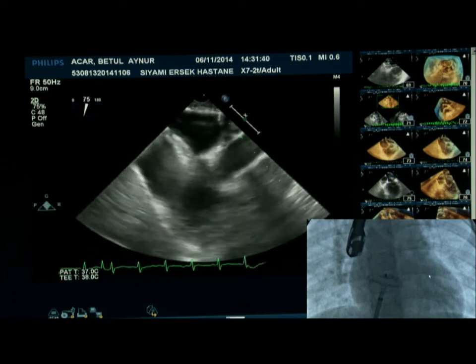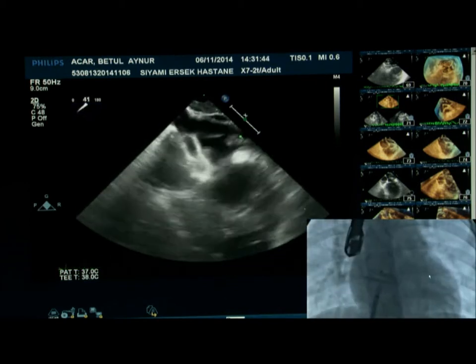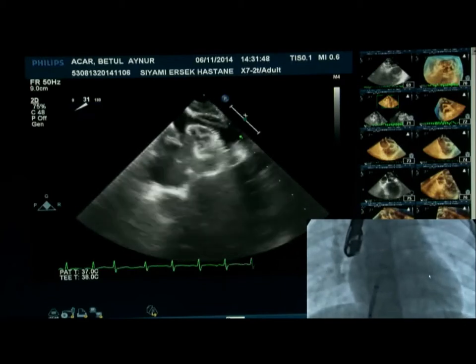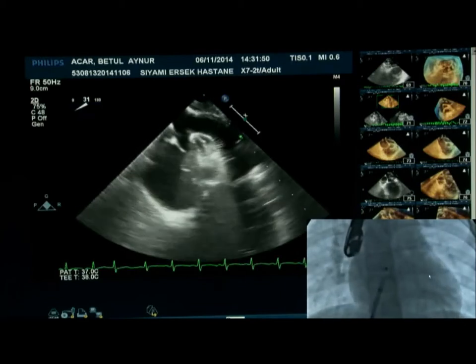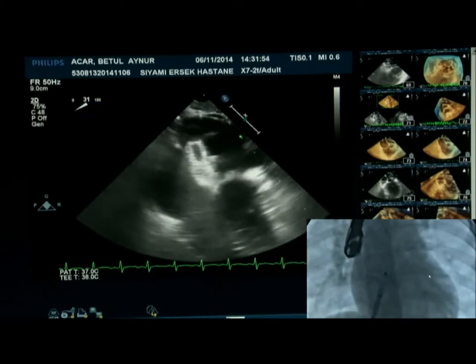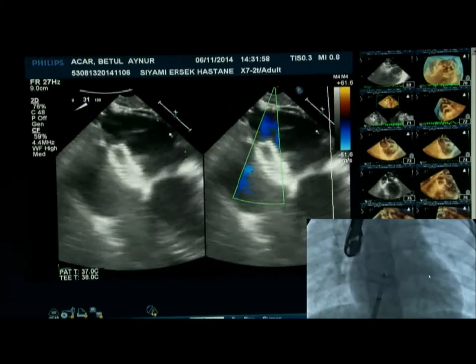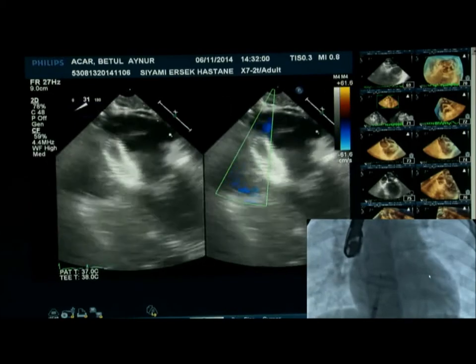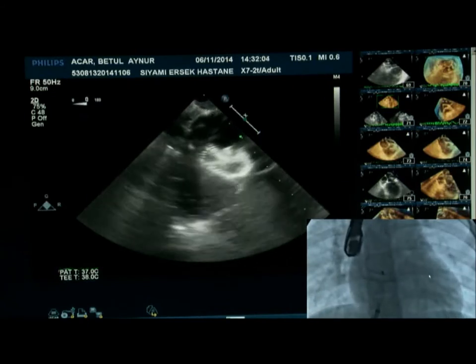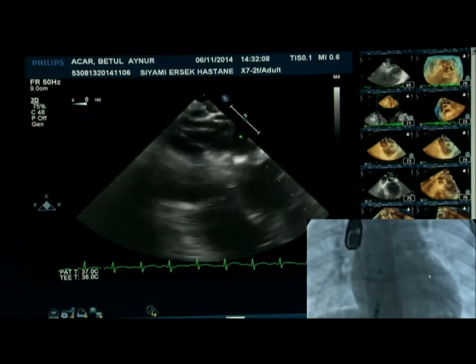Nazmi, fluoro. And no, I would go in a little bit more in the left atrium so that we capture the aneurysm mouth. So push a bit more. Yeah. Okay, so rather than pull the device in, I would deliver the waist and then pull it. So, no, I would deliver the waist a little bit. Okay, now just hold that and tell us on the TOE.